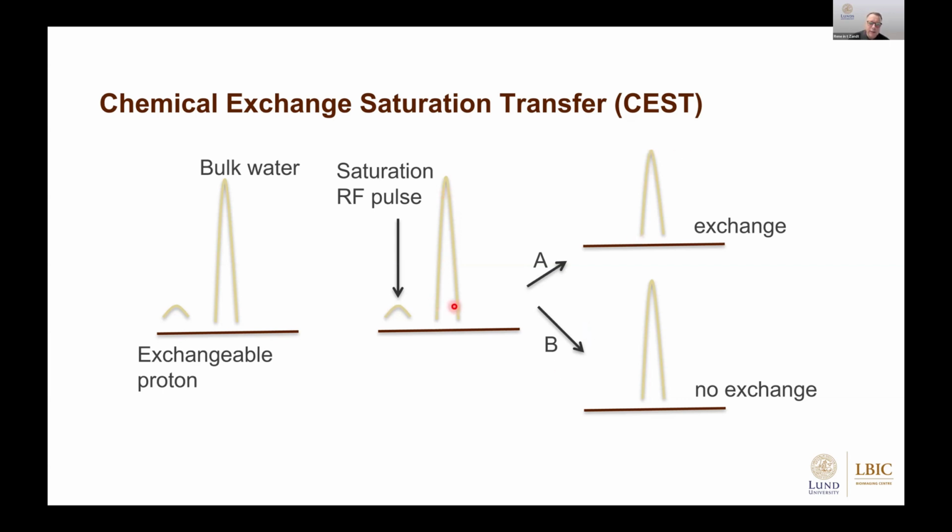And if there's no exchange between those two, the water will be unaffected. So in A, we know we have exchange, and in B, there's none. And that's basically what we do in these so-called saturation transfer techniques.